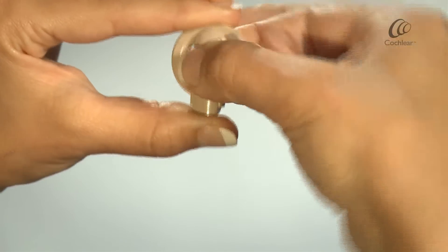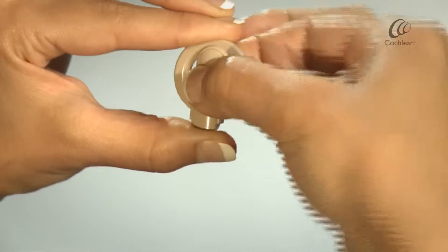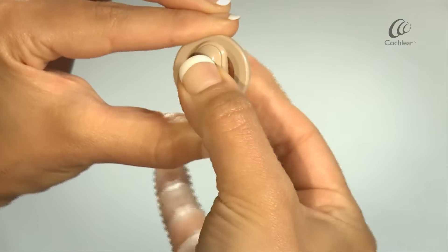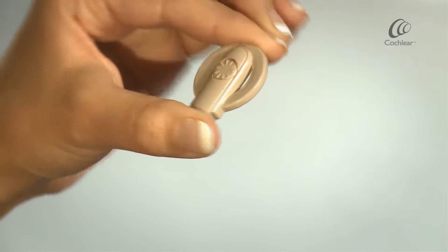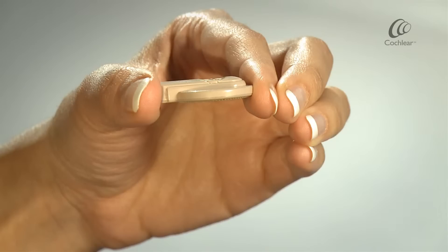If the magnet is too strong, it may cause discomfort or skin irritation. You can change how firmly the magnet sits on your head by adjusting its depth in the coil or by changing the strength of the magnet.